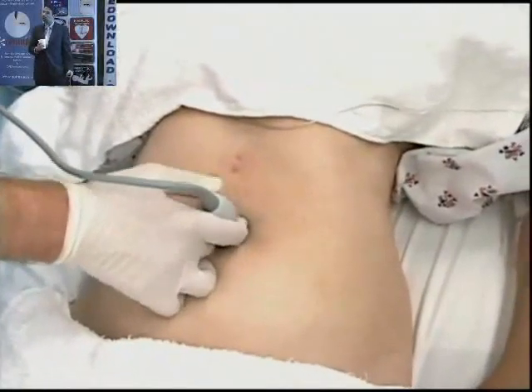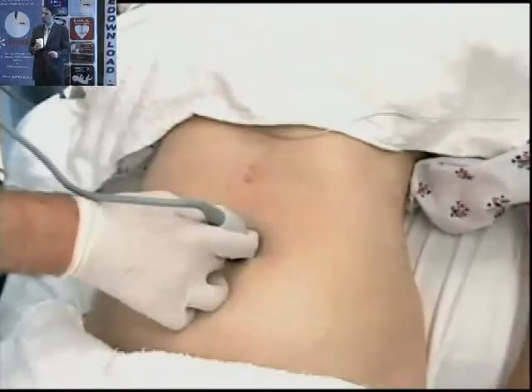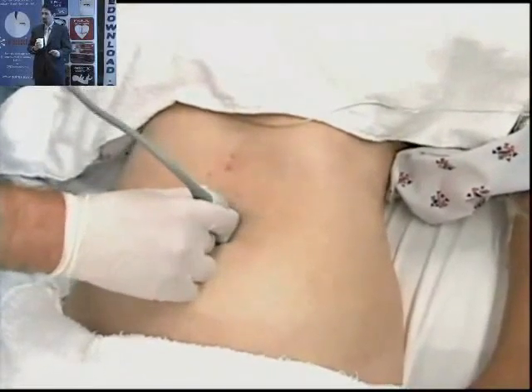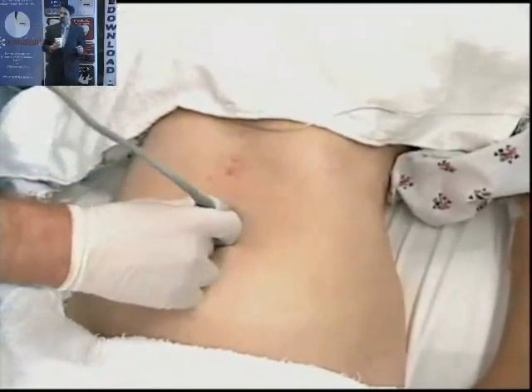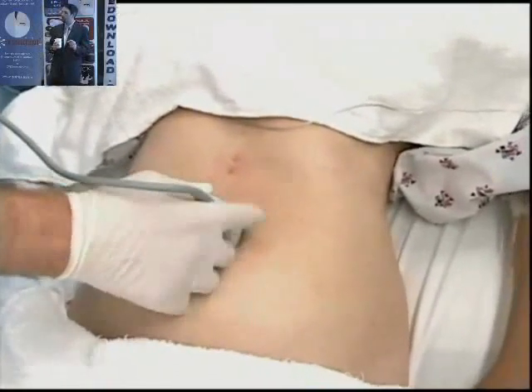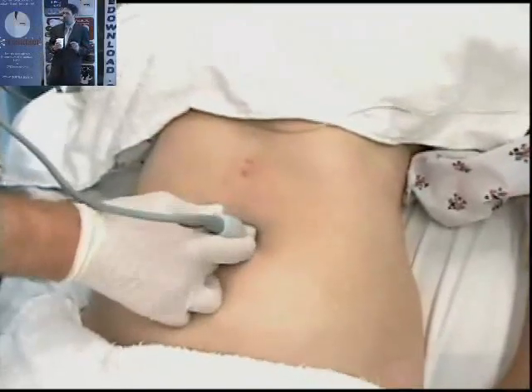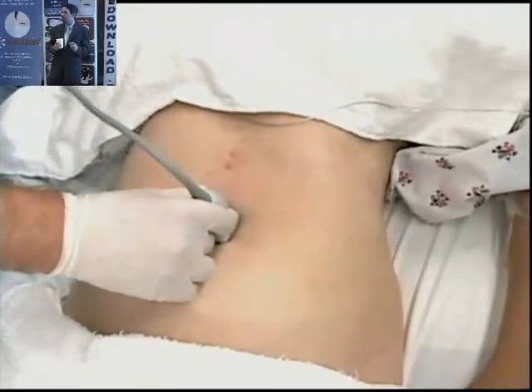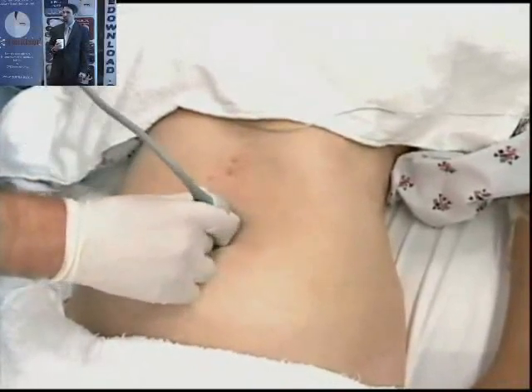This is another clip that just shows the transition from a transverse look where the probe marker is facing the patient's right to a longitudinal or sagittal cut where the probe marker is now facing the patient's head. And so this is very easy to do. What you'll want to do is you'll find the aorta on transverse. It'll look like a big circle. And then you put that circle directly in the center of your screen and rotate 90 degrees so that the probe marker is now facing the patient's head. And you're going to see that circular structure turn into a tubular structure. You can be able to visualize it over its entire course.